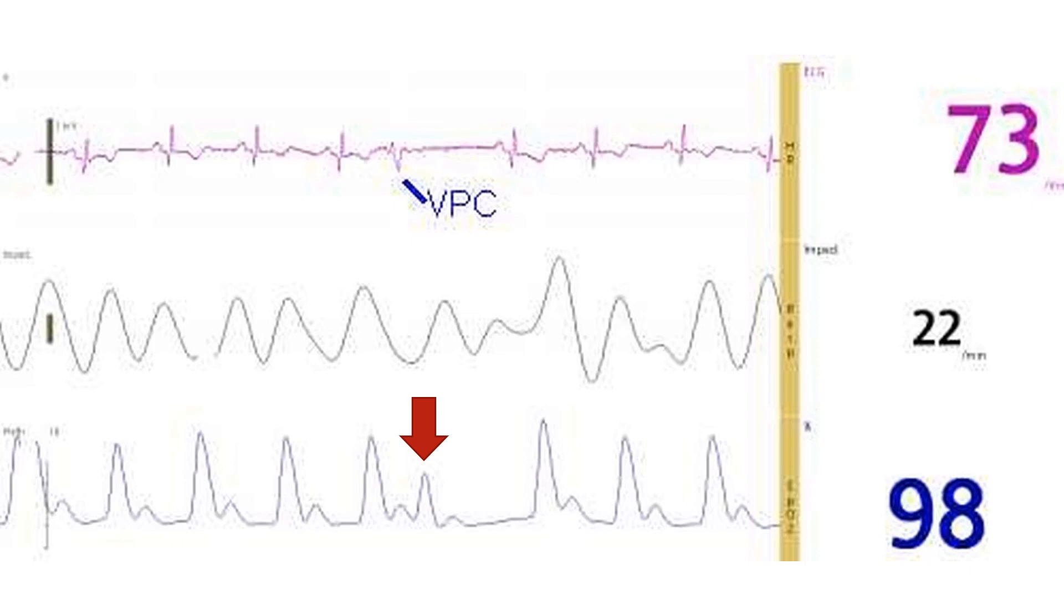The next beat following the compensatory pause has a longer diastolic period as well as atrial booster with the preceding P wave. Hence the pulse volume is higher for the post ectopic beat. This is also reflected in the pulse oximetry tracing.